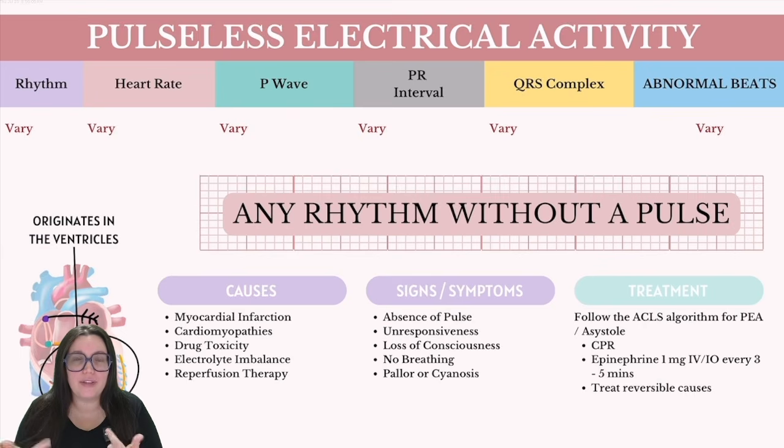So the big key here that I want you to remember is that when it comes to PEA, you're going to see electrical activity on the screen. But the electrical activity does not mean that mechanical activity is taking place. Even though the heart's electrical system might be functioning appropriately, it may not be receiving the signals it needs in order to help the heart contract. So while we say electricity, just remember that electricity does not mean mechanical activity.